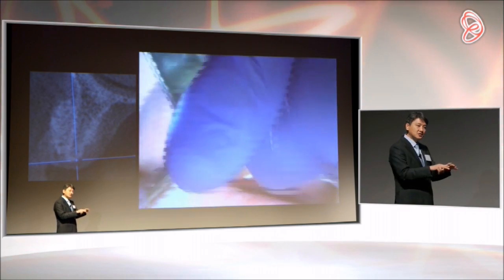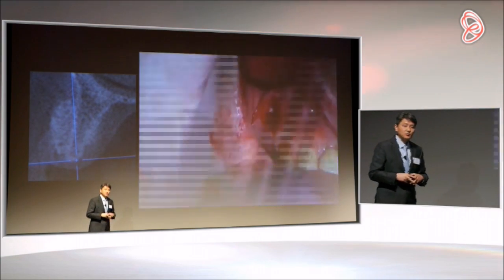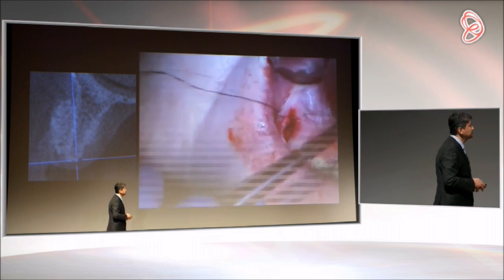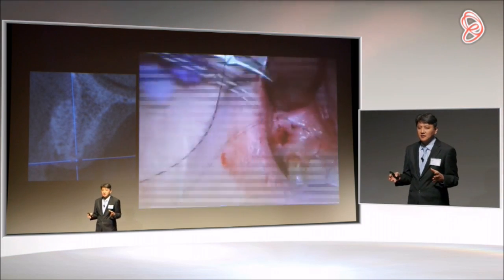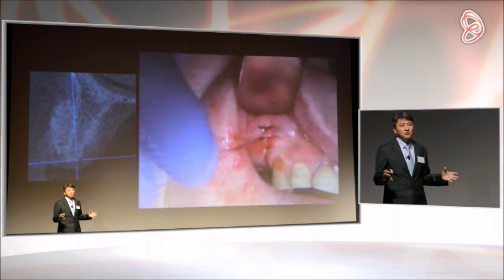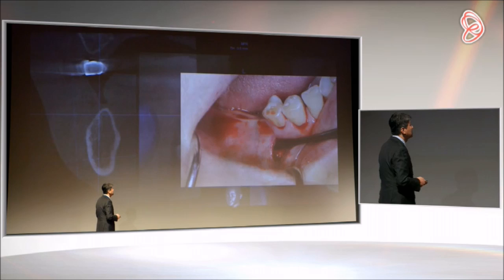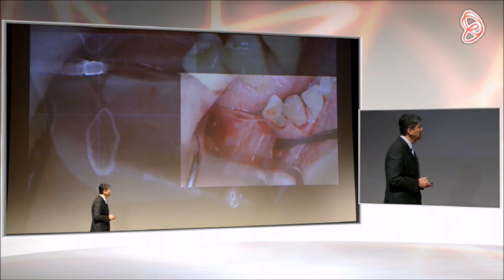And then we will massage the patient to eliminate the dead space, to prevent any infection, and just simple suturing technique is done. So very simple procedure, and the bone grafting surgery has reduced from 2 to 3 hours to just a 15-minute procedure. So I truly believe that this is the best technique out there. It works really well for the mandibular as well.